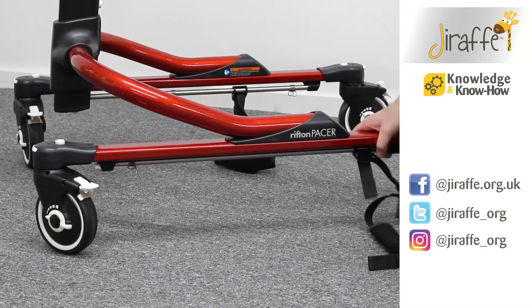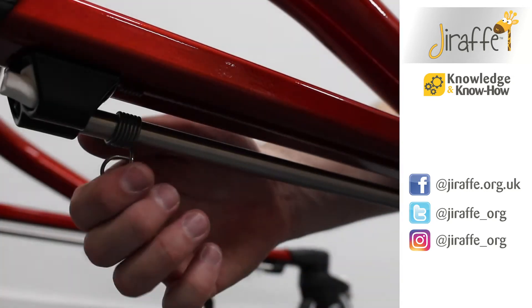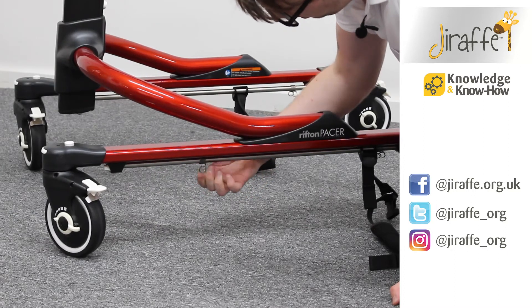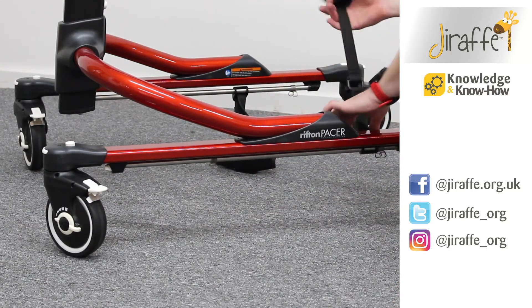You can see underneath the frame here we've got two metal pins that we can adjust along the frame. These can set the stride of the ankle prompt, so that the ankle prompt is not able to go further than that point.